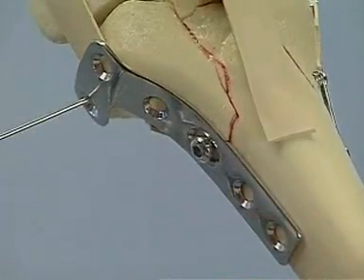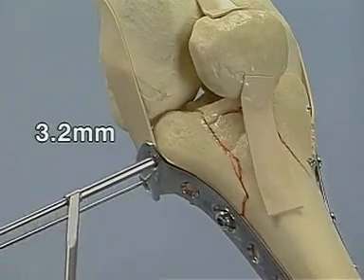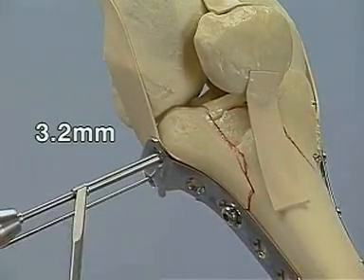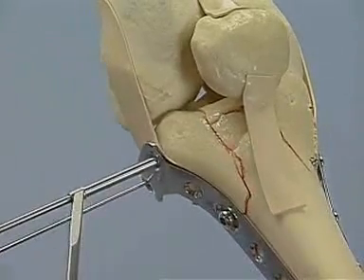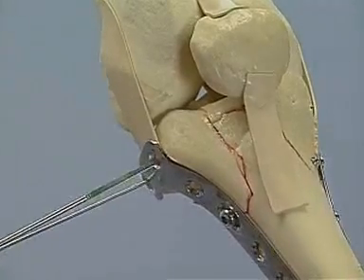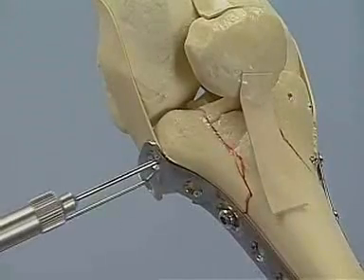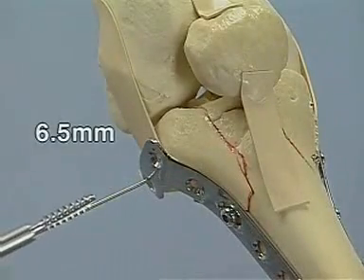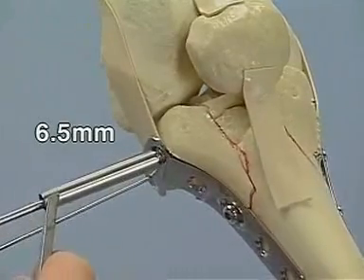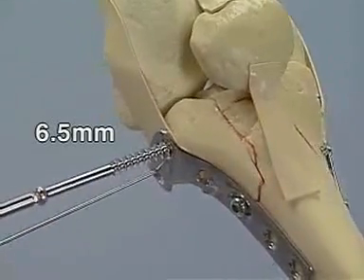The placement of a 4.5 mm cortical screw without tightening it completely. After possible correction of the plate alignment, the 6.5 mm cancellous bone screws are now placed parallel to the joint line. Drilling with the 3.2 mm drill bit. Depth measurement. Tapping with the 6.5 mm cancellous tap. Finally, application of the 6.5 mm screw with a long 32 mm thread.